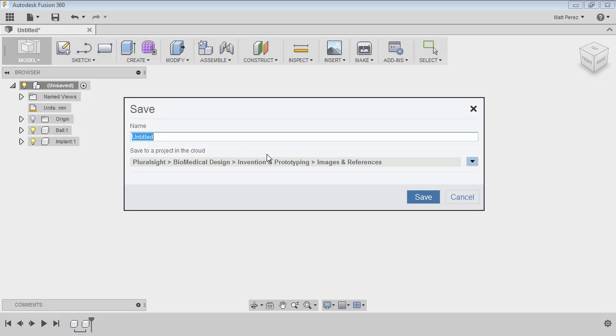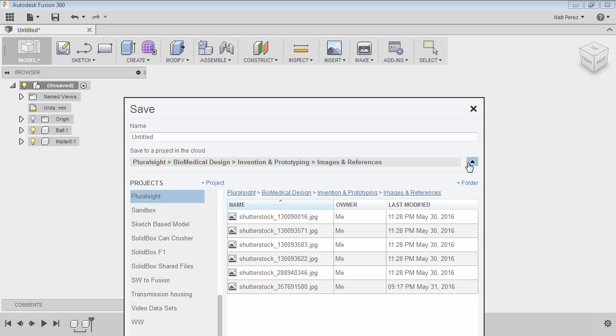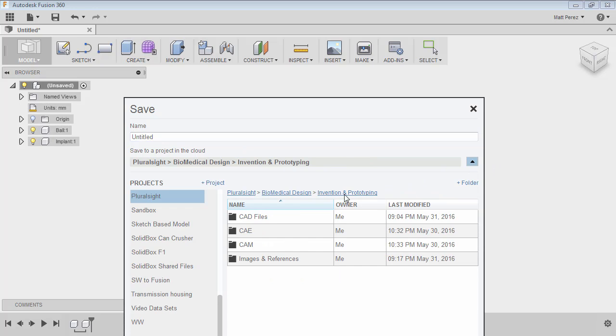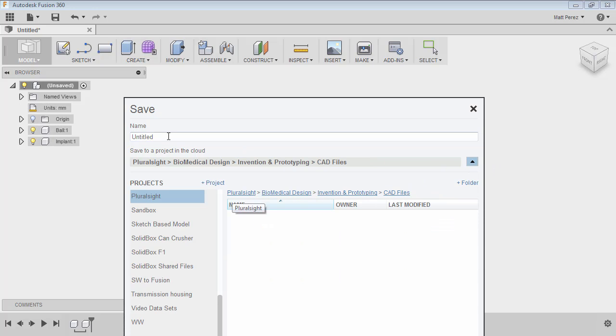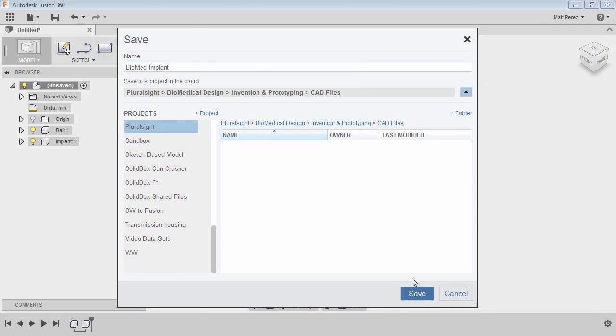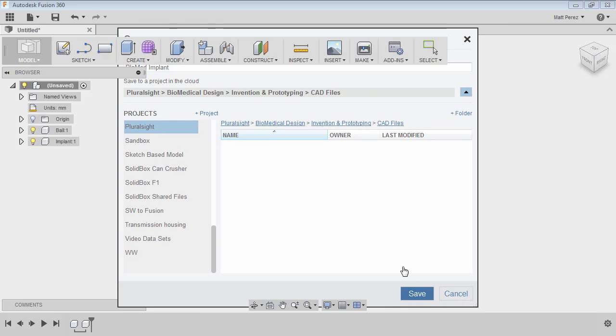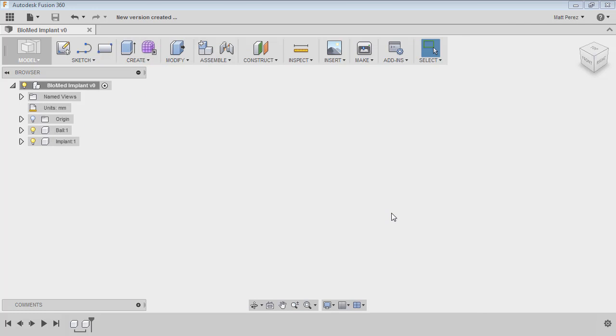You want to make sure that it's located in the appropriate folder. In this case, I'm going to have to go down to invention and prototyping, and I want to stick this in CAD files. And I'm going to call this 'biomed implant'. We're going to go ahead and save that. So now we have a version zero biomed implant that we've created, which really has no geometry, has no pictures—it only has two individual components.